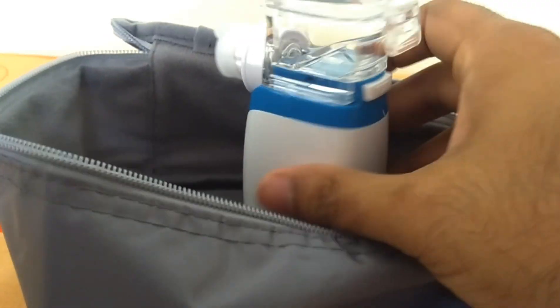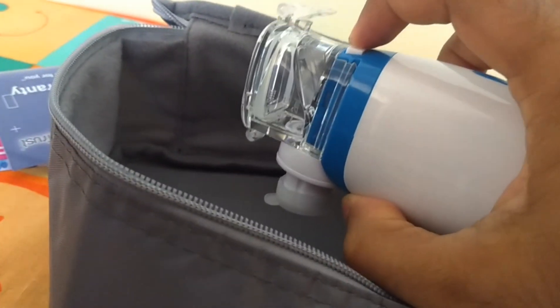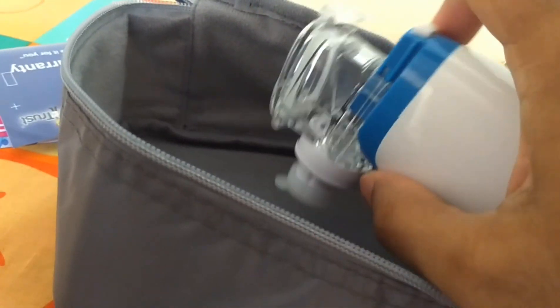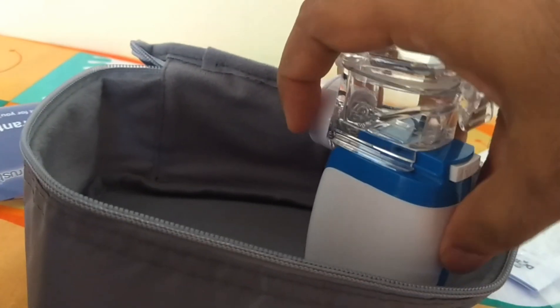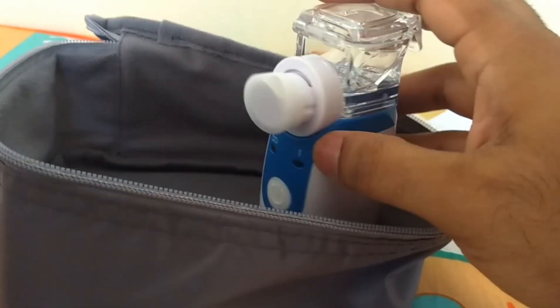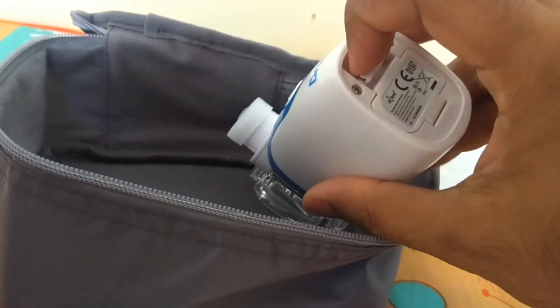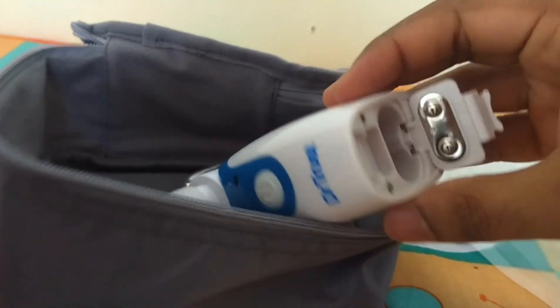Let me connect both of them together. Did you hear the tick sound? You see this push button — this is used to detach the chamber. And this is the compartment for putting the battery.